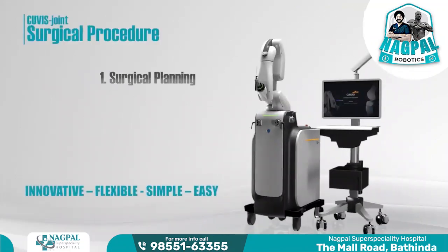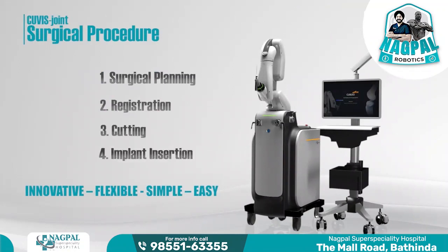The CUVIS joint procedure starts with the surgical plan establishment. After matching the CT data with the actual patient information, the robot automatically cuts the bone, and then the implant is inserted.